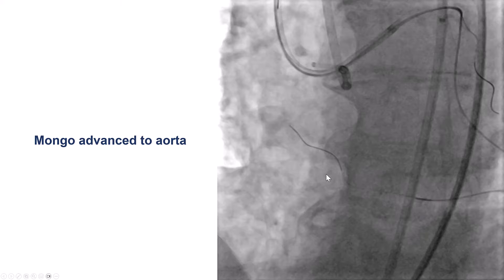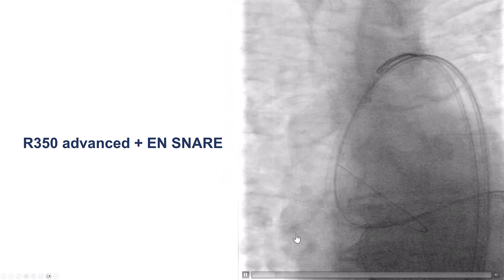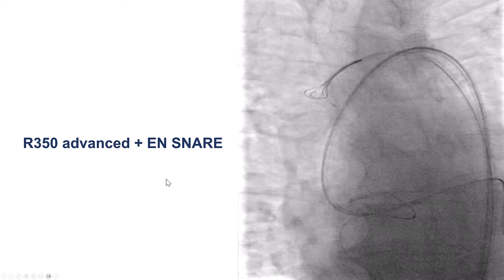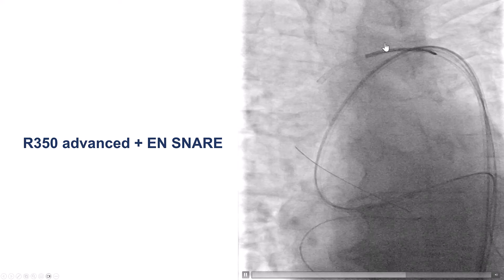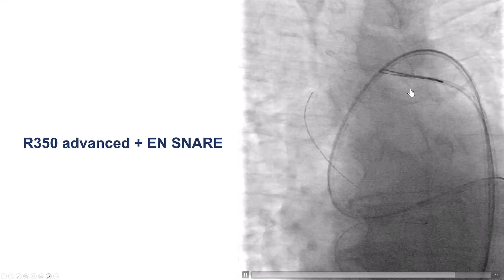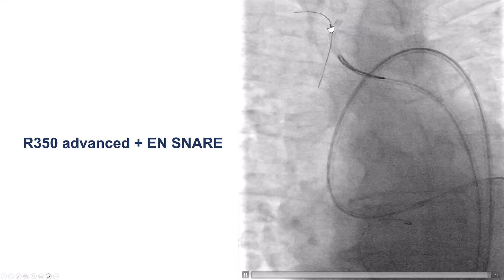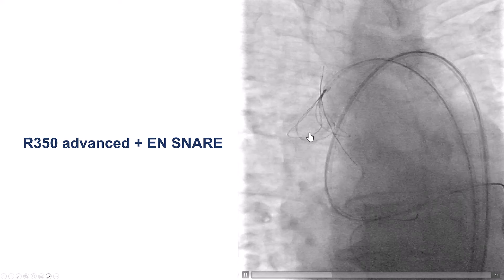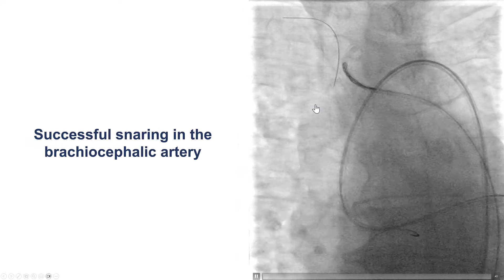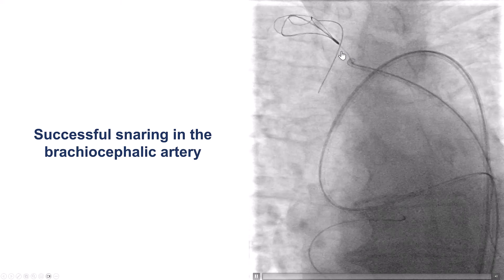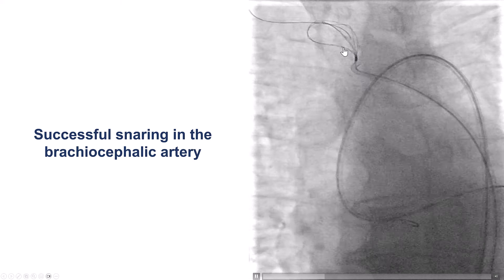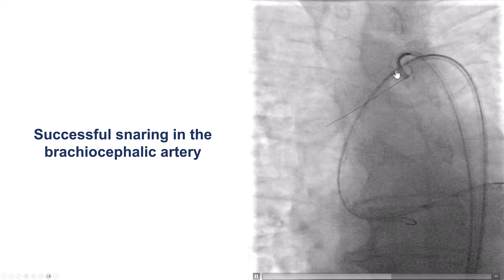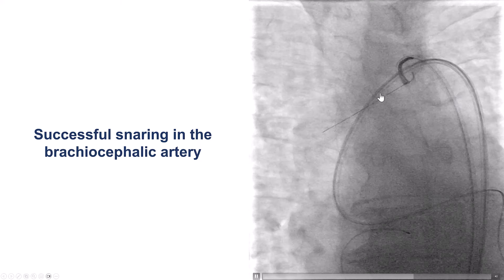We were able to advance a retrograde Gladius Mongo all the way into the aorta. We then advanced the microcatheter into the aorta and switched the Mongo for an R350 guide wire. The next step was to try to snare the wire using an N-snare. Unfortunately, we had a lot of difficulty snaring the guide wire — it looked like it was going through, but it was actually in a different plane. Eventually, we advanced the guide wire into the brachiocephalic, got the snare in the brachiocephalic where the space is smaller, and were able to successfully snare the R350 using a JR4 and an N-snare.